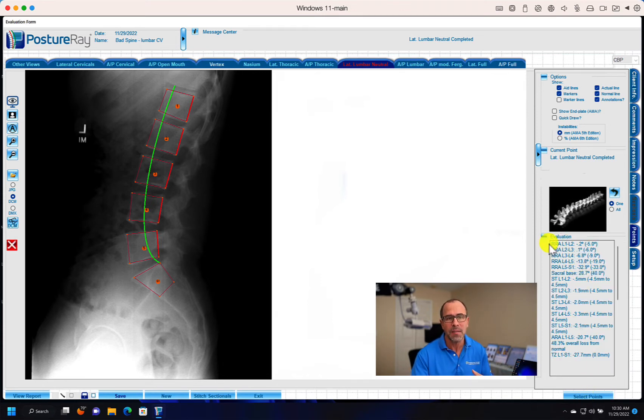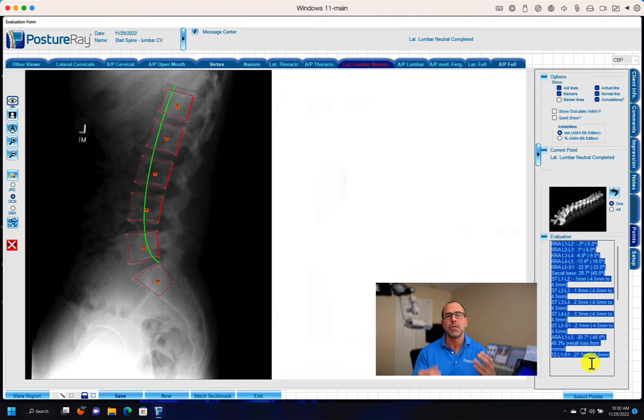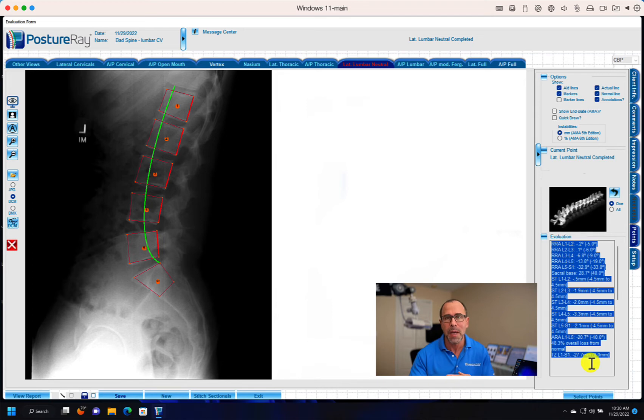How awesome is this? It's not just putting lines on a film. It's literally measuring your documentation so you know what's best for your patient.